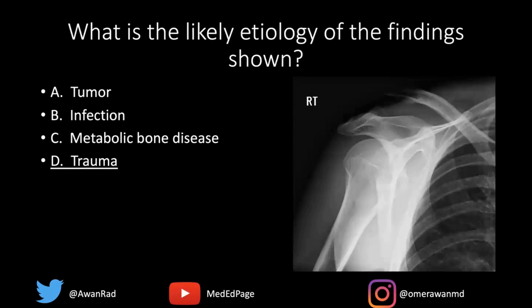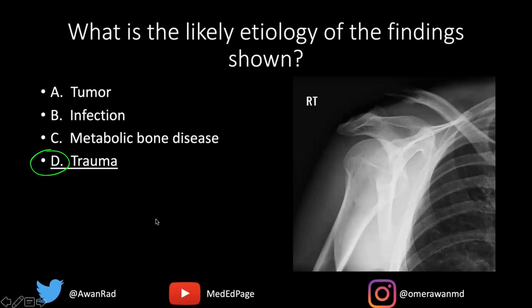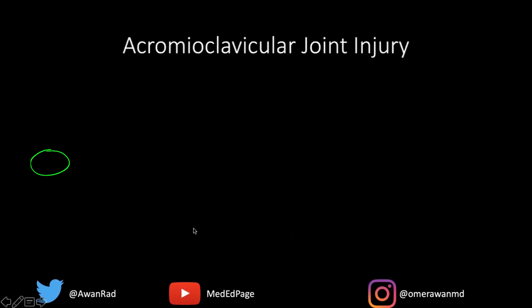The answer here would be trauma. This patient has likely had some sort of trauma that's resulted in an acromioclavicular joint dislocation or separation. It's very important to always assess the position of the clavicle with respect to the acromion process of the scapula on all shoulder radiography. If you're going too fast, you will likely miss this at some point in your career, as I did when I was a second-year radiology resident — this was a case that I certainly missed because I was going too fast.